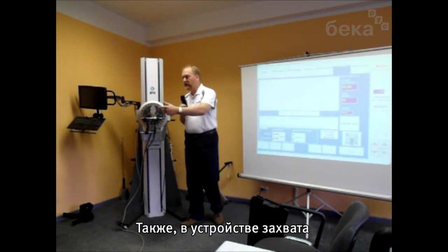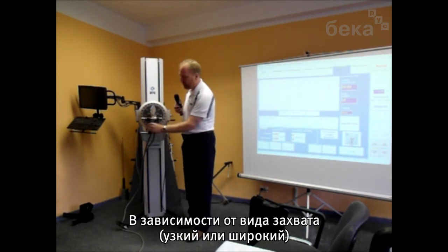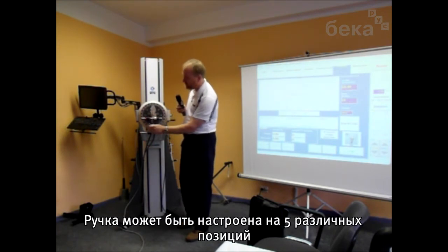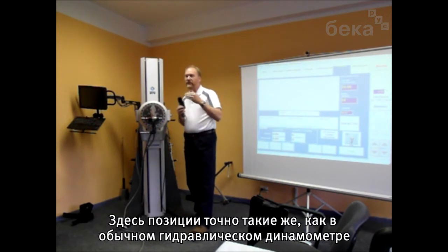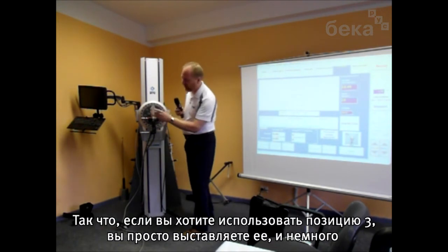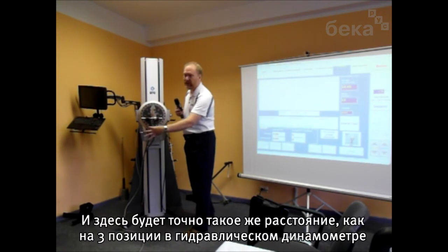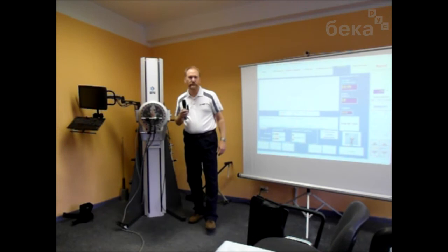Also with the grip tool, you do need to set up the handle to the proper position depending on whether you want a small grip or a wide grip. This can be set to 5 different positions, 1, 2, 3, 4, and 5. Those correspond to the 5 rung positions of a standard hydraulic dynamometer, like a Jamar dynamometer. So if you want to use, say, position 3 for grip strength exercising, you can put the pin in number 3, and when you push the handle up to touch the pin, that gives you the equivalent size of position 3 on a grip dynamometer.